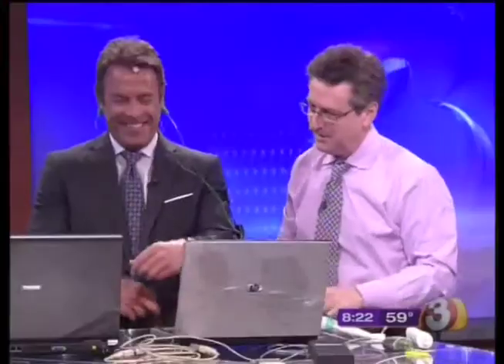Anyway, he's going to play this game. He's going to share how his brain works, but you're also going to share how people can use this in general. Good morning, and thank you for being here. Good morning. Okay, what is this used for besides figuring out what this guy is all about? Or not.